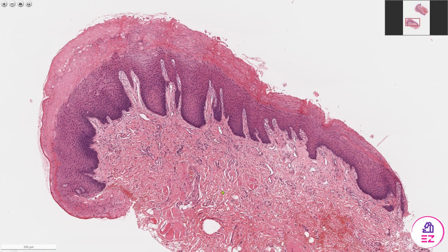Hello, and welcome to Path Made Easy. Today's case is fairly straightforward. It's an example of hyperkeratosis and epithelial hyperplasia affecting the buccal mucosa within the oral cavity.